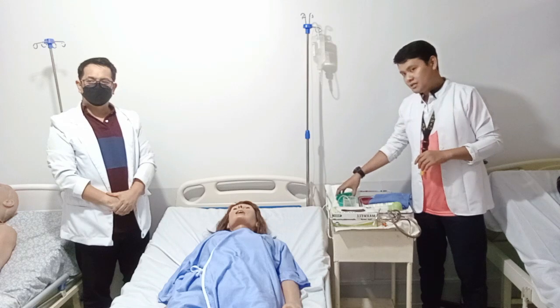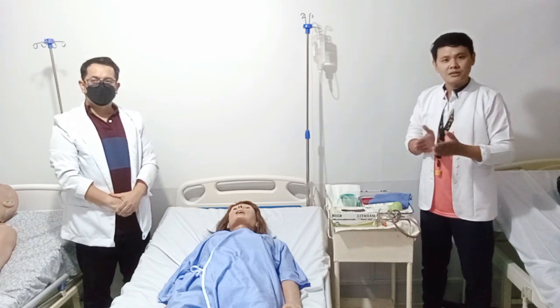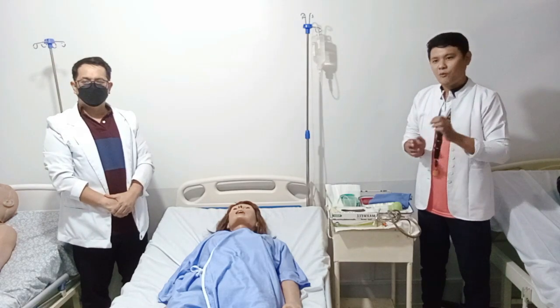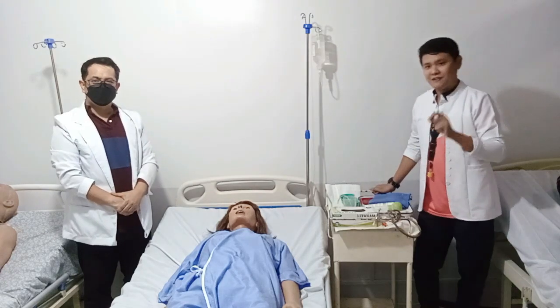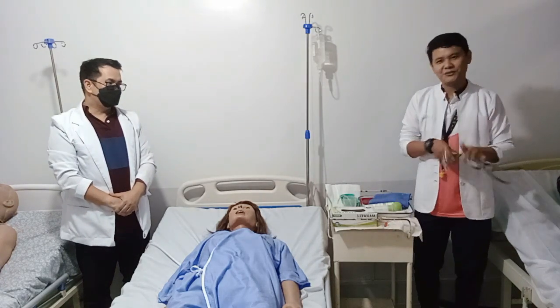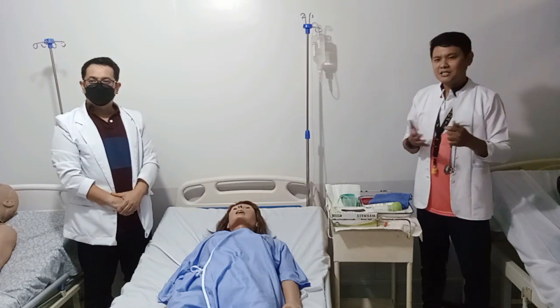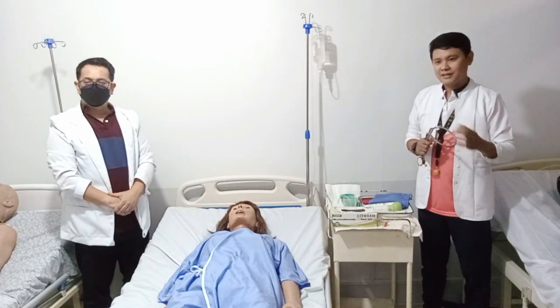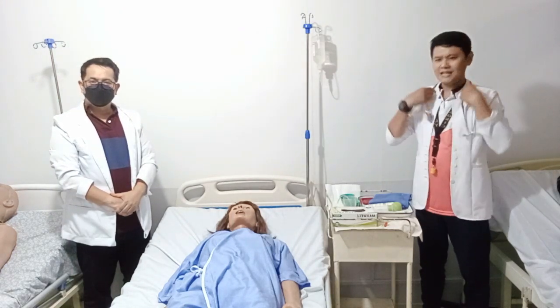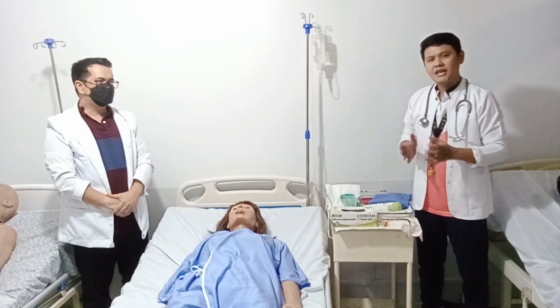Additional equipment includes a kidney basin, and if you have a pH test strip or meter, that's better — but it is optional. A stethoscope — this is a very important one, do not forget it. We're going to use a disposable pad or towel, a clamp or plug, an anti-reflux valve, and lastly, a suction apparatus if available.